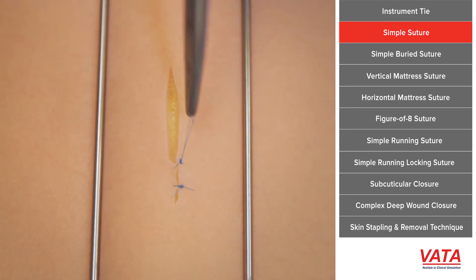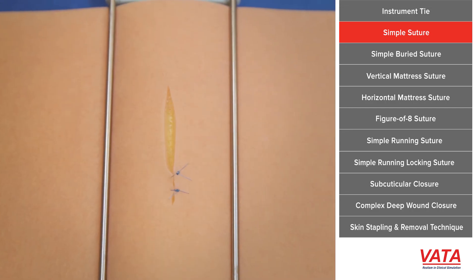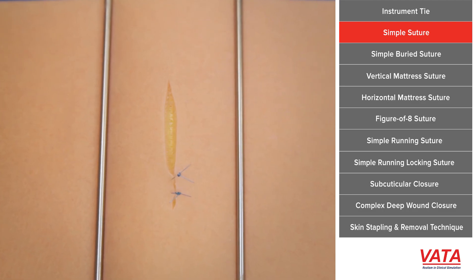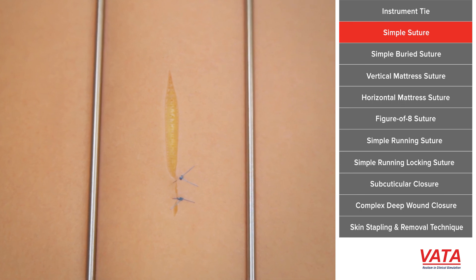That's going to help you re-approximate your skin. You'll decide how far apart each stitch needs to be — the closer they are together, the more stitching you're going to be doing and the more scar you may have. Some tissues are already just about approximated, so you don't need that many stitches.